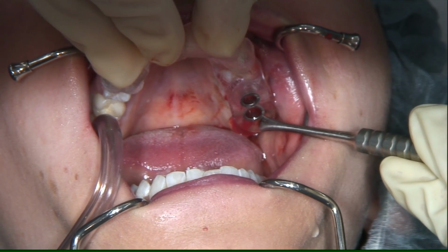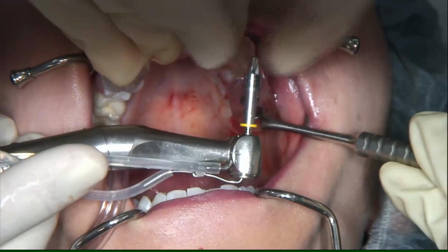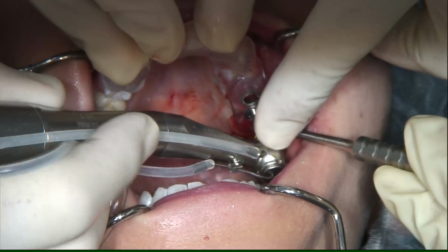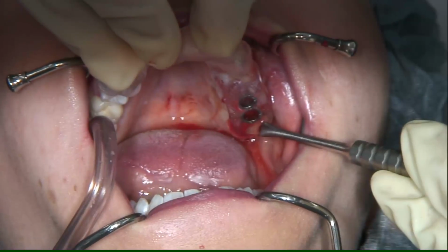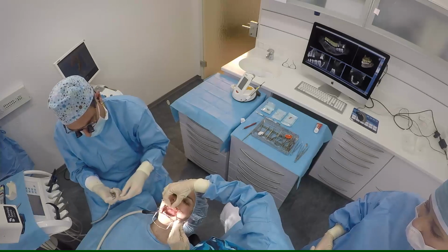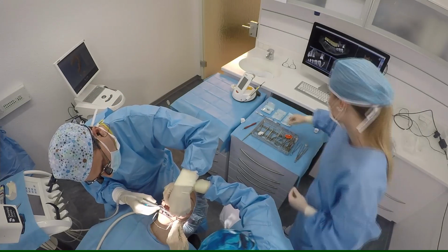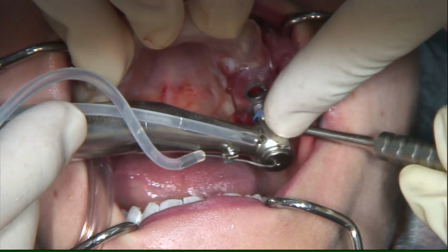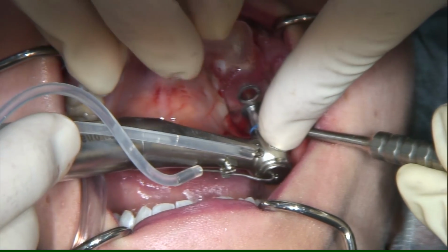Xive has a very interesting design. On one side, in the crestal area, it has a condensing thread section, and in the apical area, self-tapping progressive threads. I will go more closely into this, but let's go back to the drill protocol. That was the countersink, or let's say the Xive crestal twist drill. Now comes the last diameter. You see blue. Here we are planning not a 3.8, we are planning a 4.5 millimeter Xive implant.